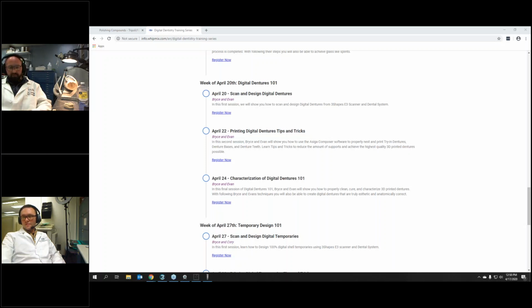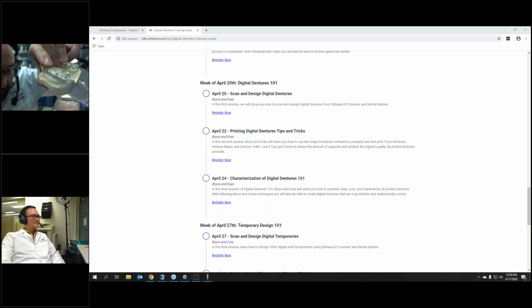There was a question about, can you show us the fit of the splint on the cast one? I'm assuming the one on the stone model. It looks off on the posterior. It is off on the posterior from the design. I mean, it didn't actually lap all the way over. If you look at the actual lap there, it's almost completely flat, kind of hard to see. It doesn't actually go all the way around, but I'm not going to blame the dental lab or the designer for this one. The bottom line is it fits. It just doesn't wrap as far over as the other one that we saw on the printed model. It fits all the way around, and if you could be here in person, you could see that it is going all the way down on the cusp tips where it was wrapping over. Yeah.